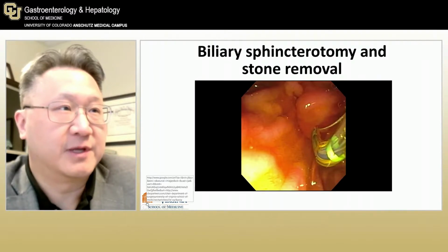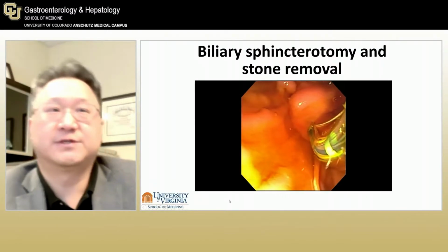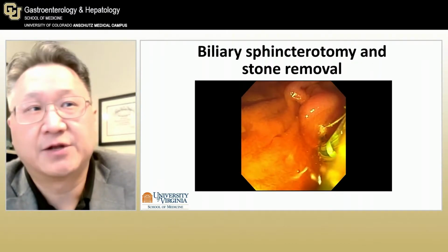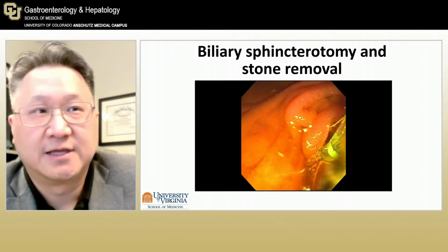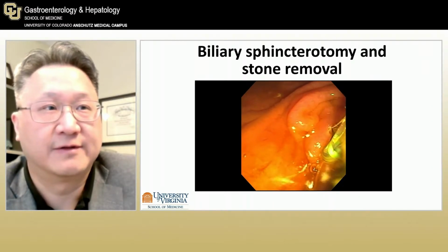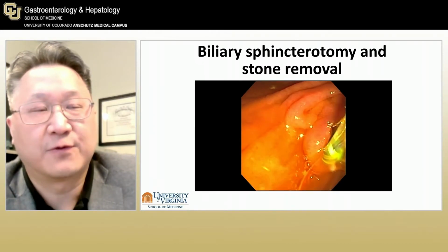So I'm going to be talking about biliary stones, which is a very common problem for those of us who do ERCP. This is a standard ERCP. Patient has small biliary stones, let's say 10 millimeters or smaller in size. This is a conventional traction sphincterotomy. We're using blended current. And here we're trying to make it adequate for the size of the stone.